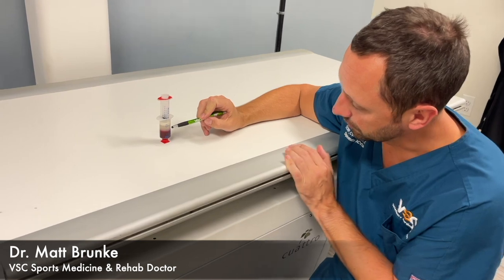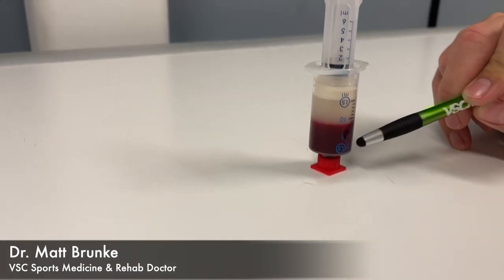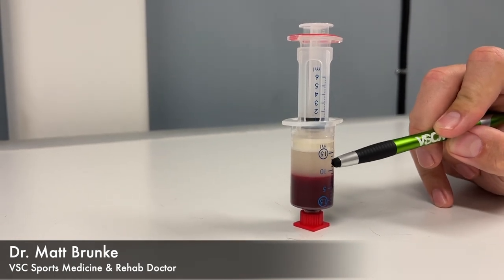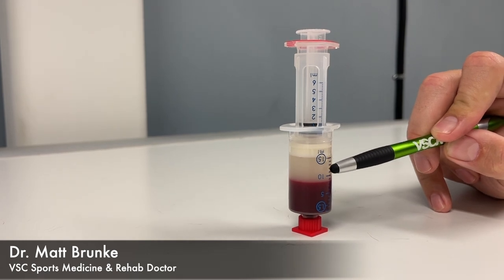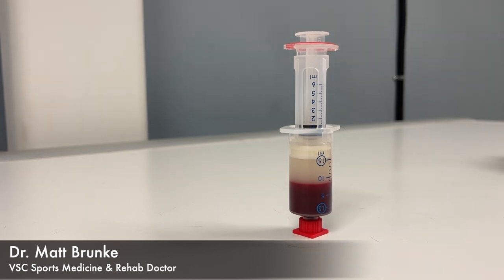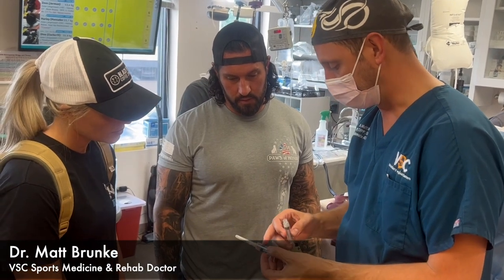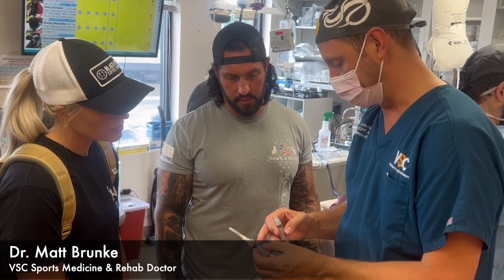After spinning Hurricane's blood, we've got the red blood cells at the bottom, and all the platelets have floated to the top with some of the white blood cells. We're going to pull off this top portion — that's going to be our platelet-rich plasma — and we're going to inject that into Hurricane's left hip to get him some good pain relief from his arthritis.